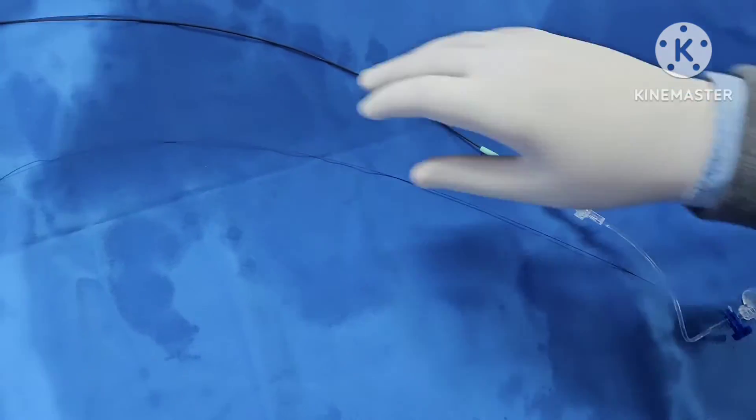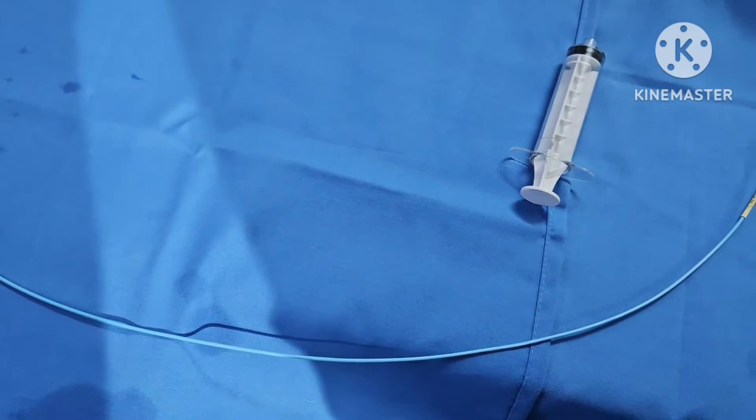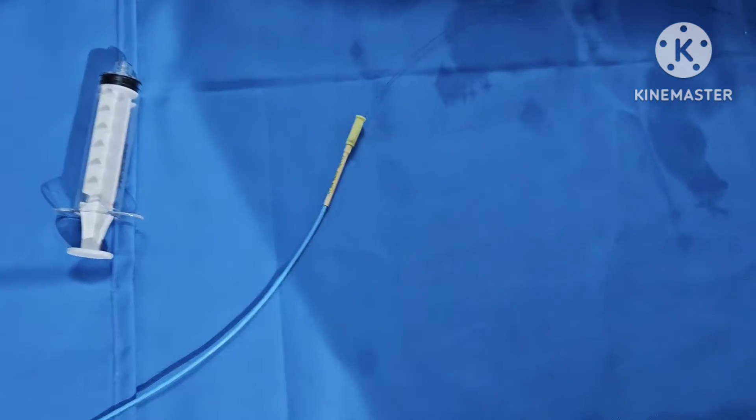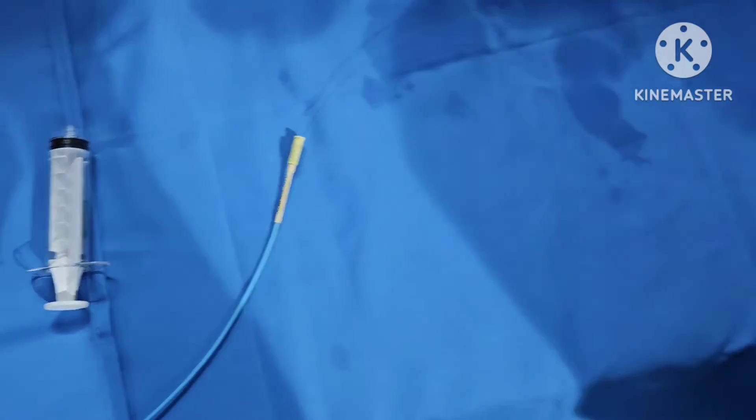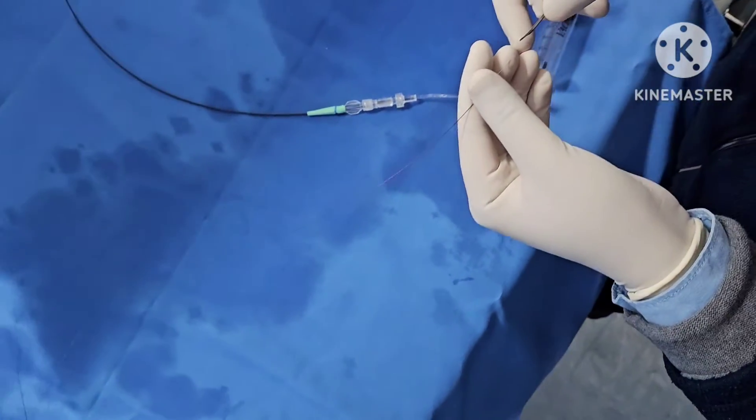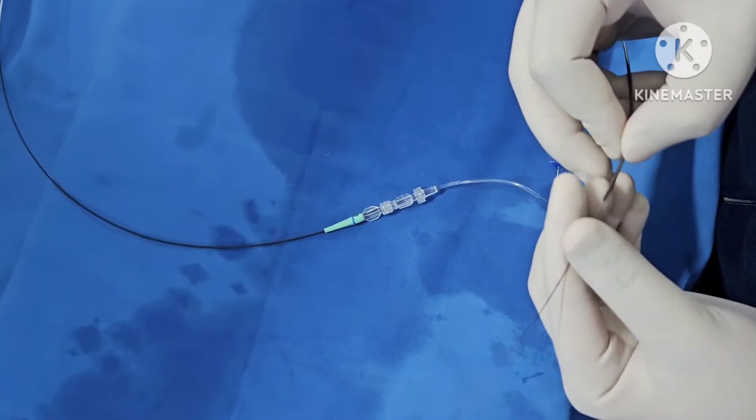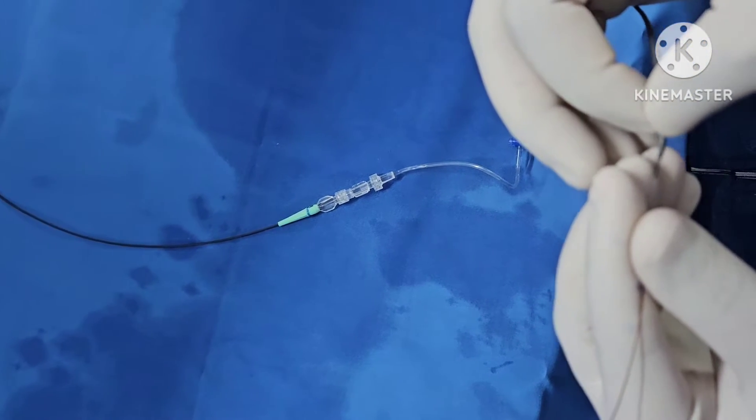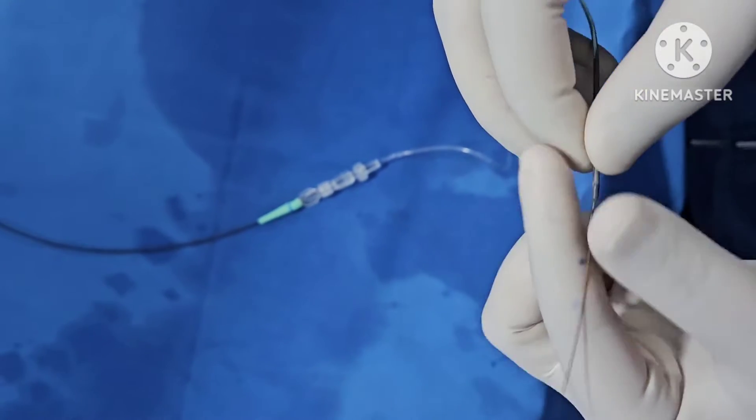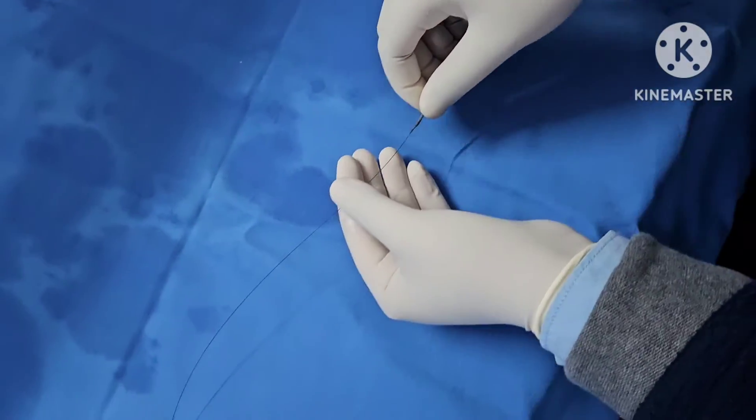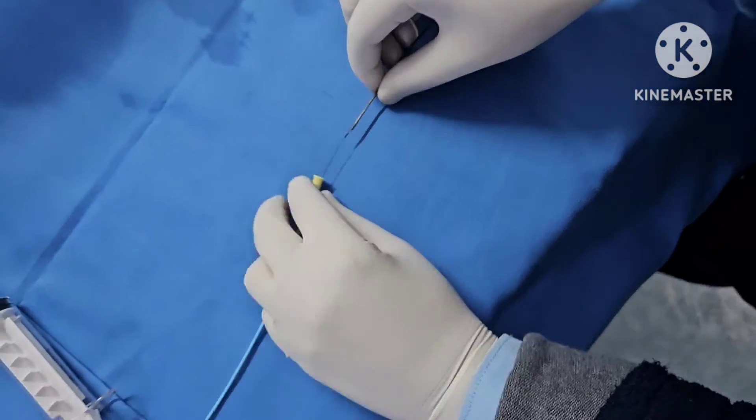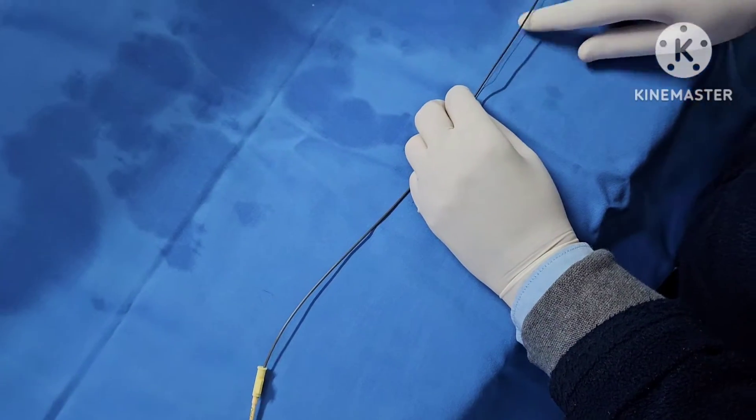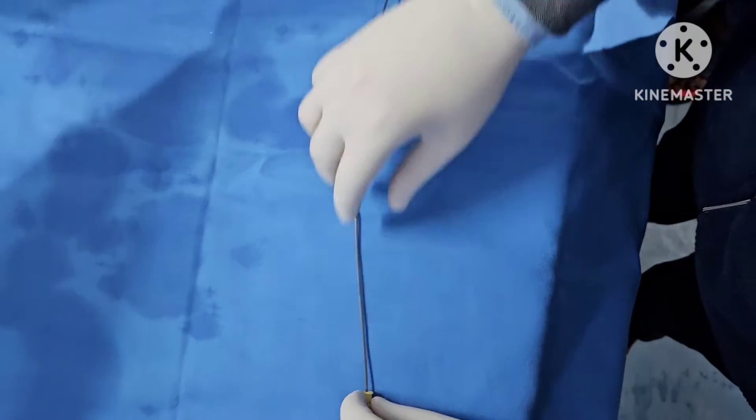Next, what we are going to do is we are going to introduce it over the wire. So you take the video. You hold the catheter. Show my hand here. Yes. So I am introducing this over the wire. A little difficult with the camera on my face. Okay. I am going to introduce this. All right. We have to hold the wire. Just hold the wire here. Yes. Hold the wire from here. We are going to introduce it.